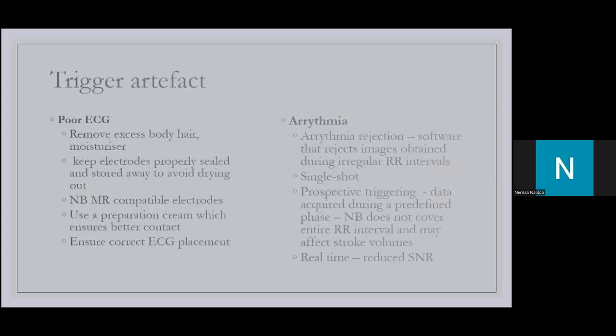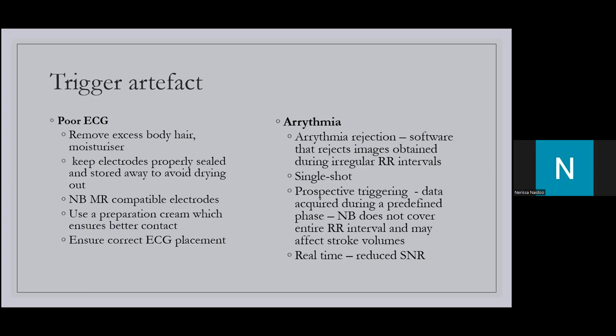How can we avoid this trigger artefact? Patient preparation, again, very important. If you've got a patient that has a lot of body hair, you take your razor, shave it off. You wipe off the moisturizer. If you've got a lot of moisturizer on the skin, your electrodes are not going to stick on very well. Just as a routine, we like to keep our electrodes properly sealed and stored away in a cool, dry place naturally. We want to avoid drying out of gel, because then again you get very poor signal. Remember, the gel doesn't just help to stick the electrodes onto the skin, it also helps to amplify the signal.